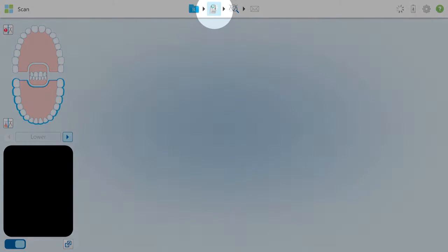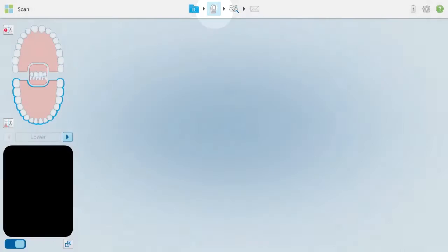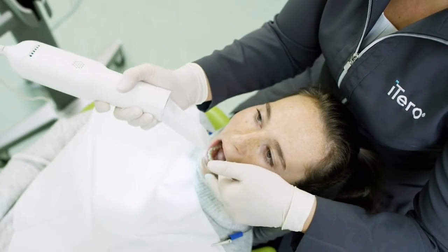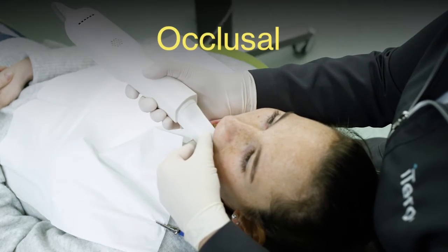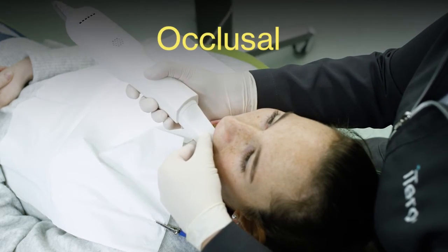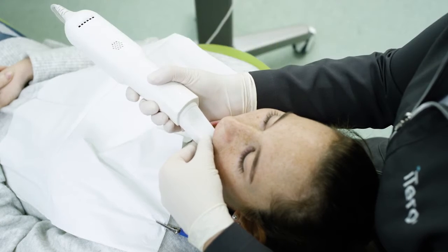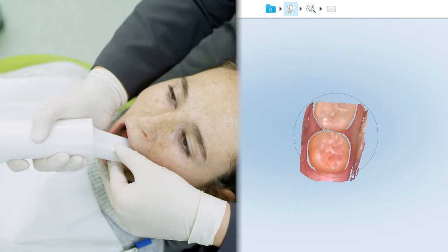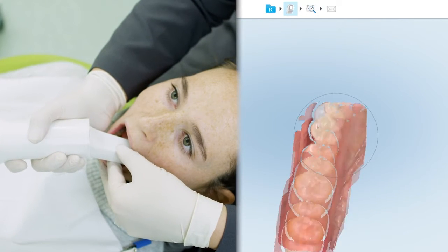Tap on the scanning sleeve icon at the top of the screen to activate the wand. Begin by scanning the entire occlusal surface of the arch starting on the terminal molar, and steadily bring the wand toward the anterior surface.